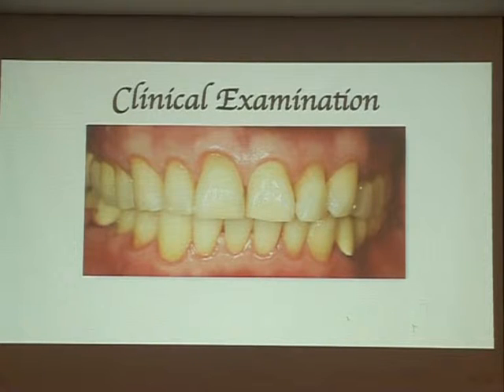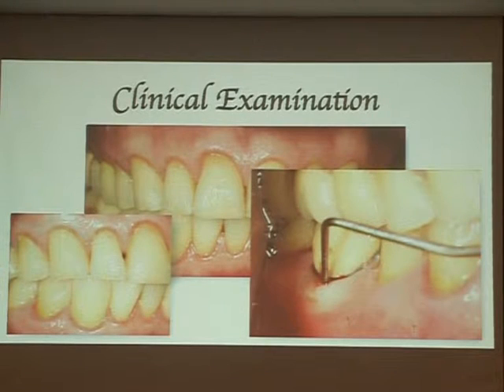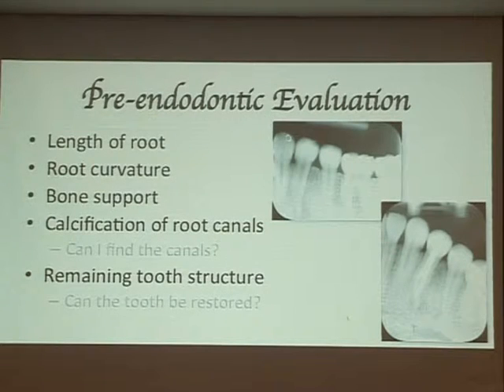So I asked him to grind the teeth. Most of the patients say, I don't know. Okay. So you check, you can see the canine guidance was lost. So I suspect it's nocturnal grinding at night. I pick up my periodontal probe, check the tooth. I can see a deep pocket on one of the molars. That is the molar causing the pain. So my diagnosis is a vertical root fracture in this case. No matter what endo you do, this case will fail. So this is an extraction case.